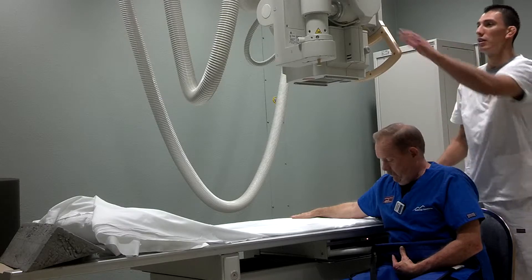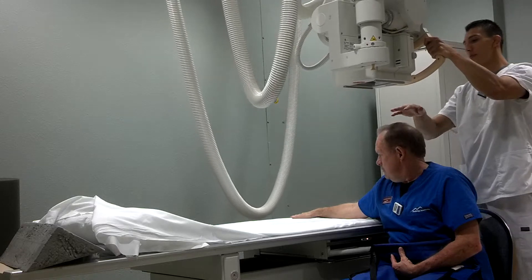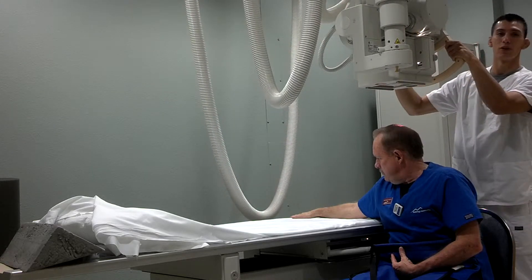And I'm going to bring the tube over without hitting the patient's head. And I'm going to angle this one 15 degrees.